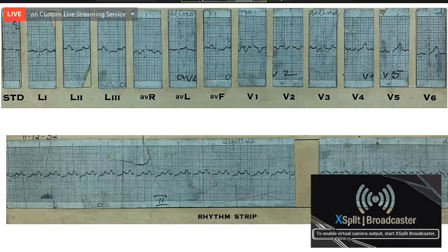So what is the condition in which you can get this combination of left atrial enlargement with right ventricular hypertrophy? What is the clinical condition where this combination is possible? That is a very simple question. You must be seeing plenty of such cases. Any one of you? This combination of left atrial enlargement with right ventricular hypertrophy.